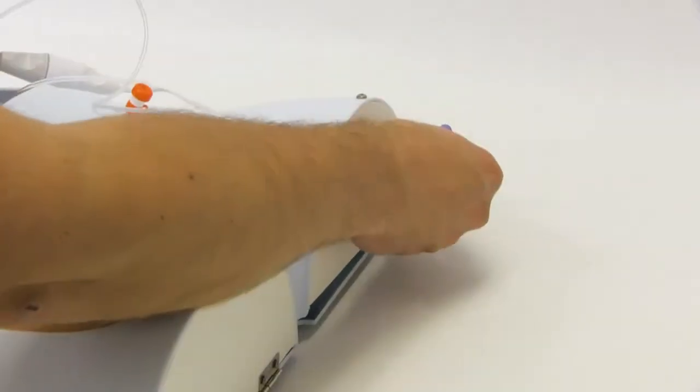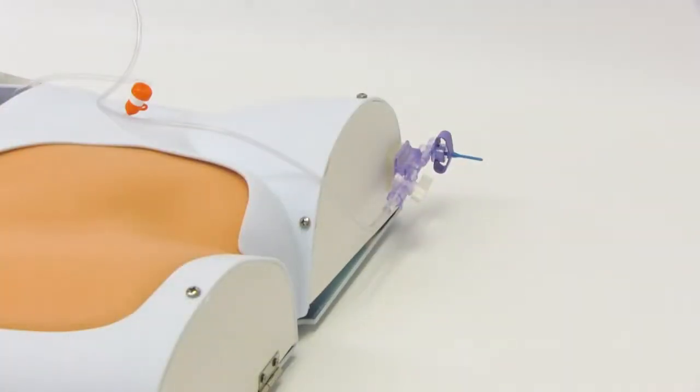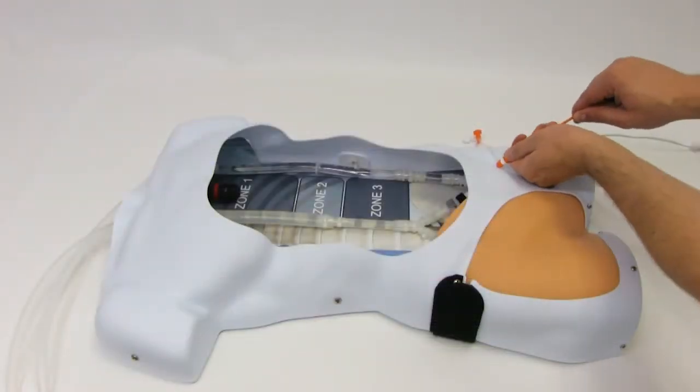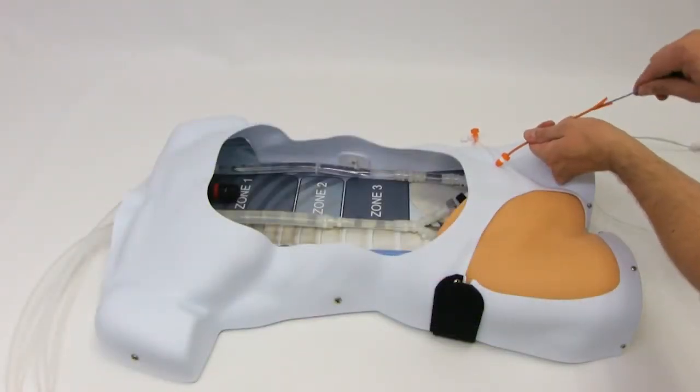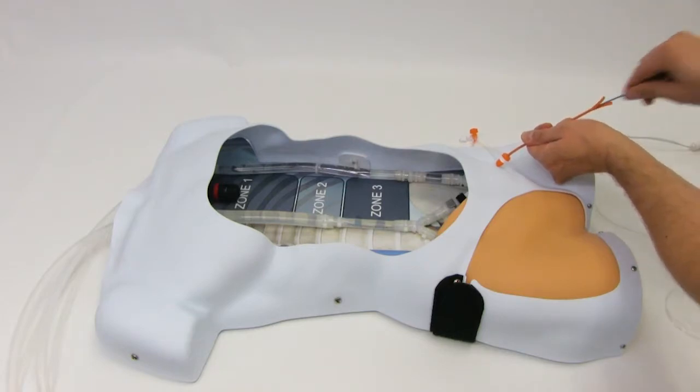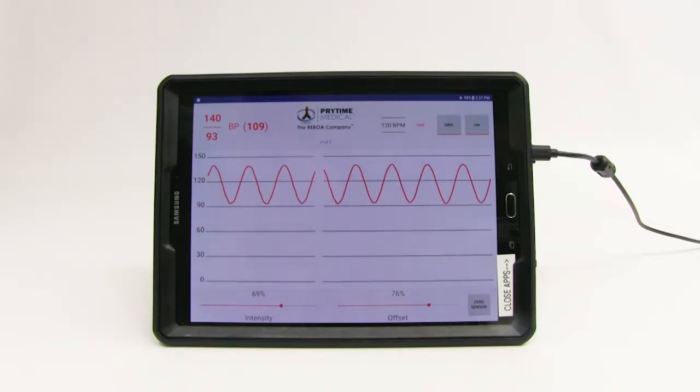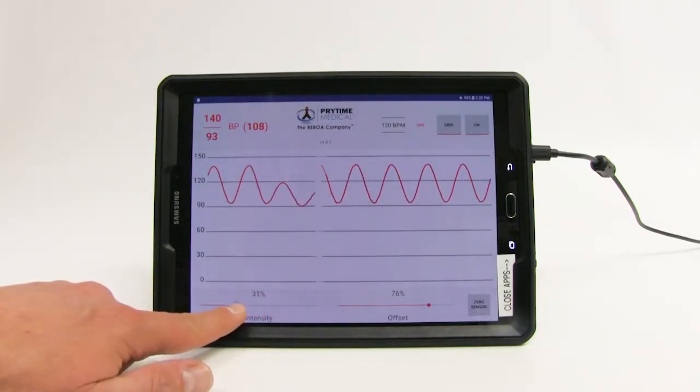Connect the blood pressure monitoring transducer to the leg cap of the model. With the catheter still outside of the model, press the zero sensor button on the screen to calibrate the sensor's readings to atmosphere. To get a blood pressure monitor reading, prepare the REBOA catheter per current setup procedures and insert it into the model. Use the two sliding bars on the screen labeled intensity and offset to adjust the waveform as needed.